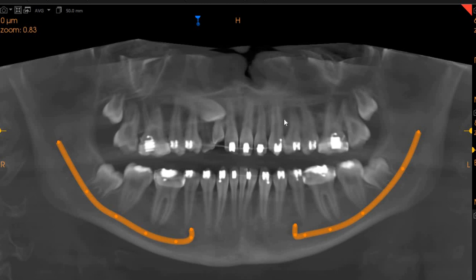On the panoramic view, you can very clearly see that the canine is placed with the roots close to the apex of the second premolar and the first molar.